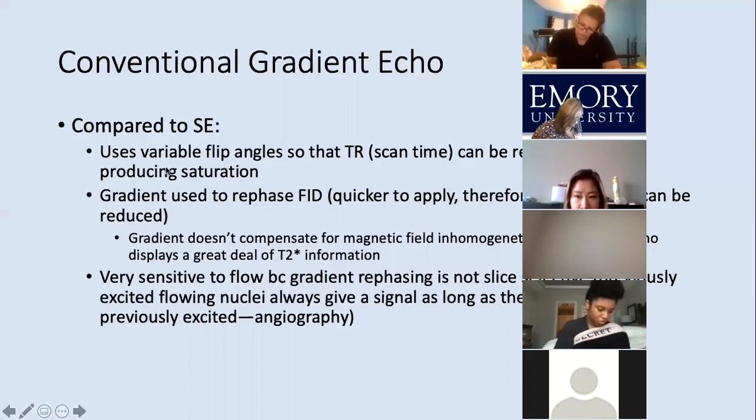Partial versus full. Partial saturation meaning past the 90 degree axis or the transverse plane. So imagine a flip angle that pushes it to 110 degrees or 120. Full saturation is complete 180, like that inverting pulse. We're flipping that net magnetic vector full 180. And what saturation means is as you get further and further away from that transverse axis, and remember that transverse axis is where we collect signal, your signal is going to slowly reduce. Okay, so you're just not going to get a very intense or bright image for that vector.